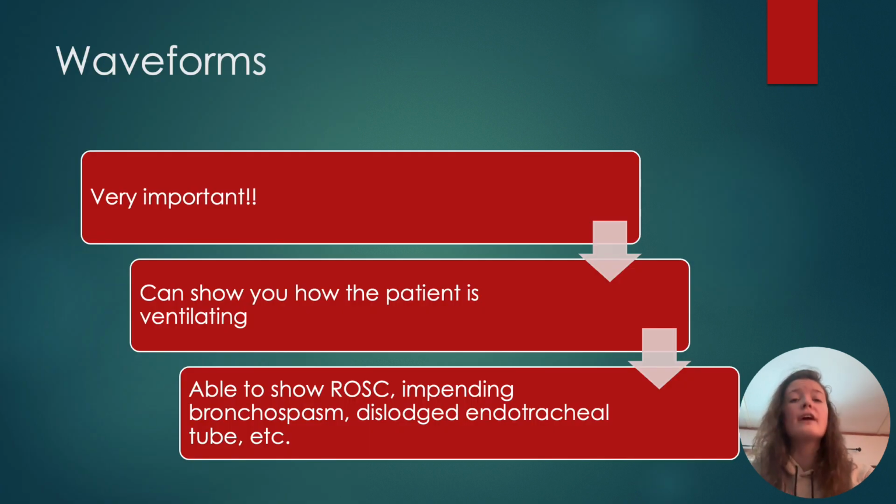So waveforms are very important. They can show you how the patient is ventilating. It is a graph. It is a picture of how their breaths are. I'll show you in the next slide. They should be a nice little box.